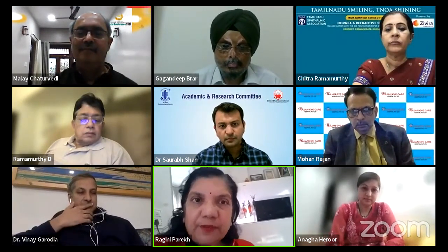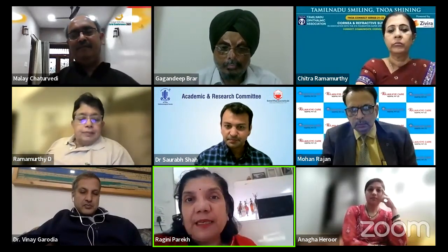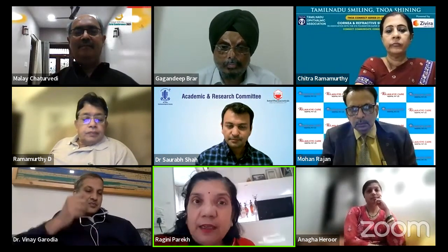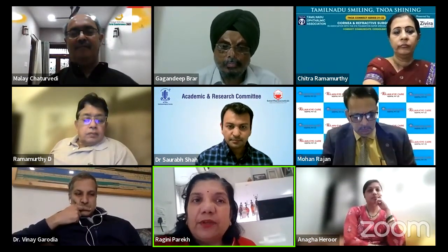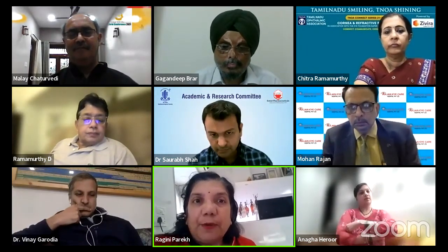But one more observation I would like to make is that these patients somehow or the other are extremely uncooperative, because probably they can see what you are doing. And these are the patients who turn up a lot to us, where we don't do any PC tomies in our own patients, but these are the patients who turn up to us 1 year, 2 years later needing PC polishing. So polishing the undersurface of the capsule is extremely important in these patients. And you have to deal with the PC plaque at a later date if it is really very big and it is going to obstruct the patient.